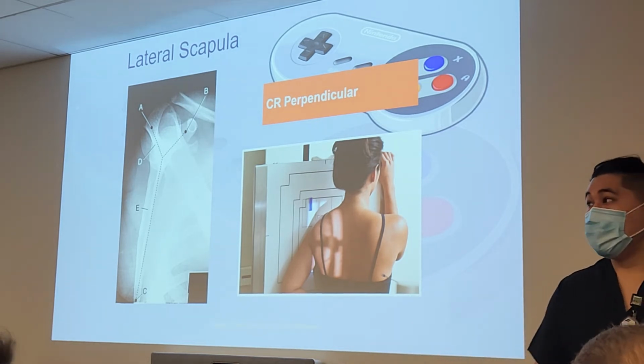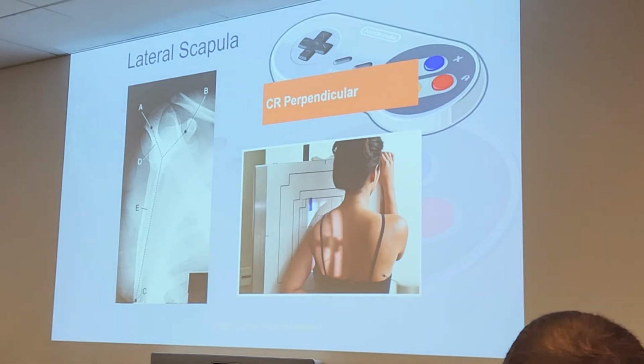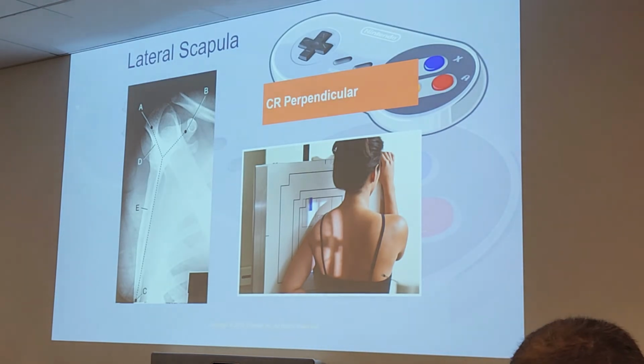Do we have this yet? The lateral scapula view, you should have a lateral scapula view. I know we have this one, but I was saying it might be slightly different in this case.